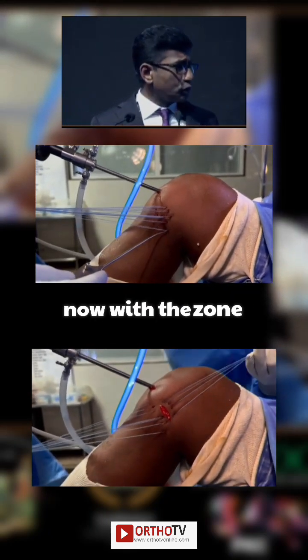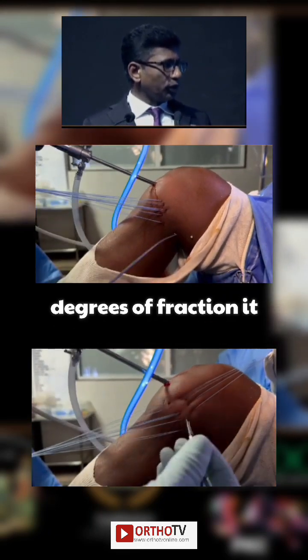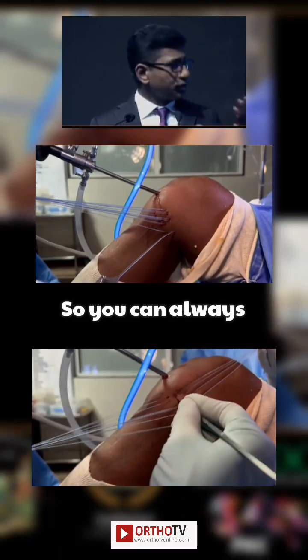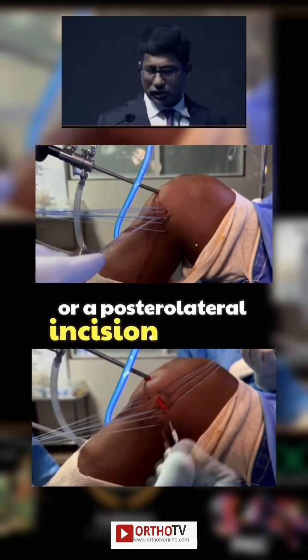I was using the safety incisions. Now, with a zone-specific cannula, with a flexion of around 40 to 60 degrees of flexion, it won't deviate to the posterior side. So you can make sure that the needles are coming in just anterior to your posteromedial incision or a posterolateral incision.